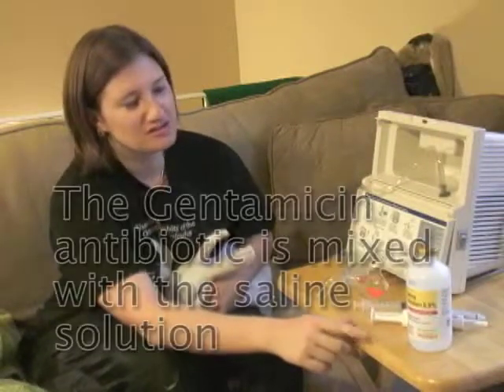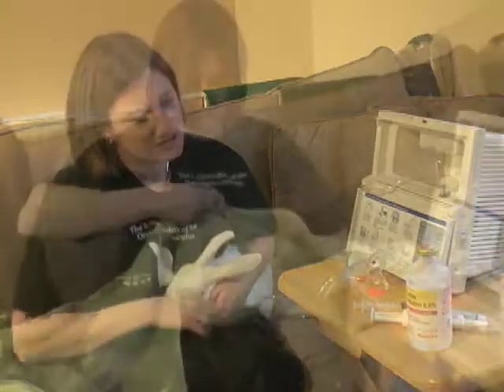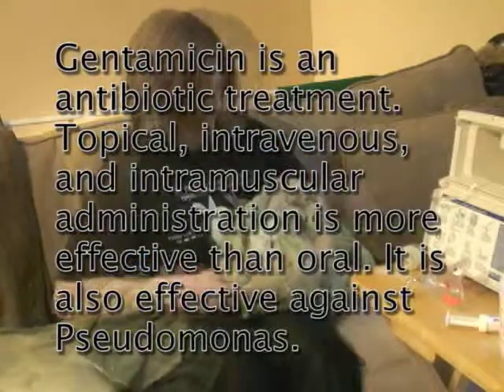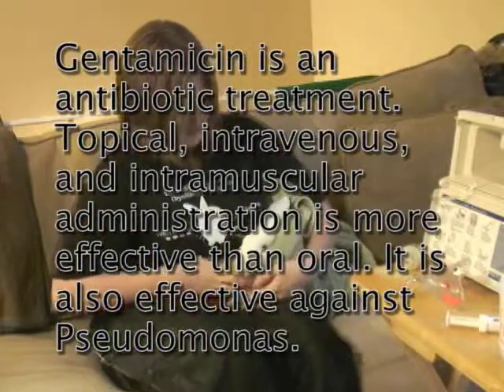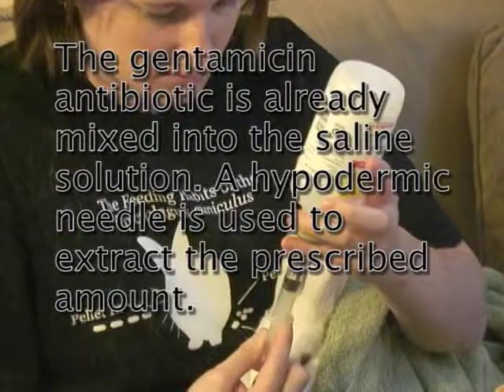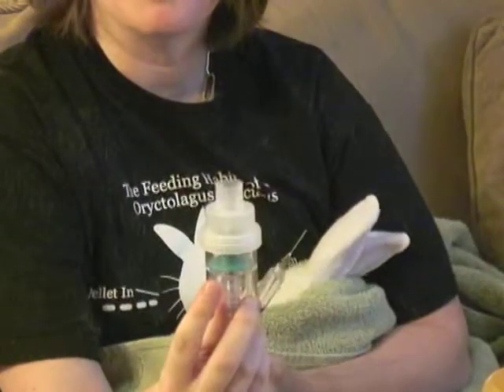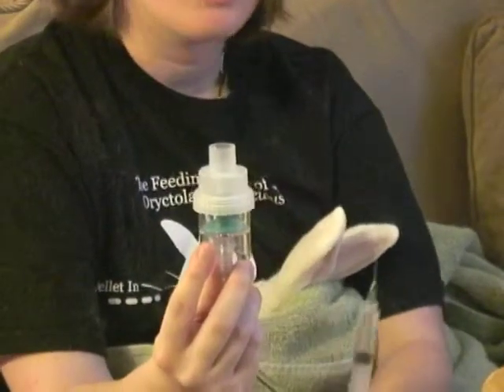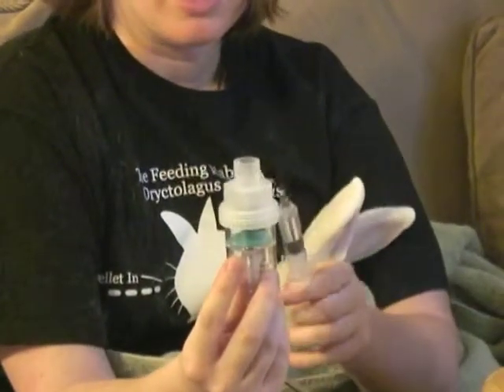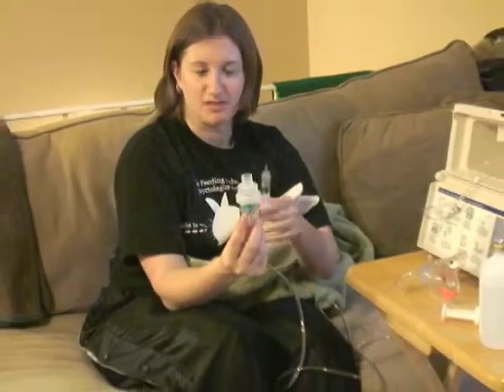This is the saline solution that we put into the nebulizer. It's mixed and diluted with Gentamicin antibiotic. Start wrapping until she's contained. I've kind of been holding her to the side so her little face is all that's left sticking out. Try to get her calm. This is the medicine cup on the nebulizer. Through this tube is where the nebulizer compressor will blow air into it, and in this medicine cup is where the saline will be — that's how the air will make it mist through here.